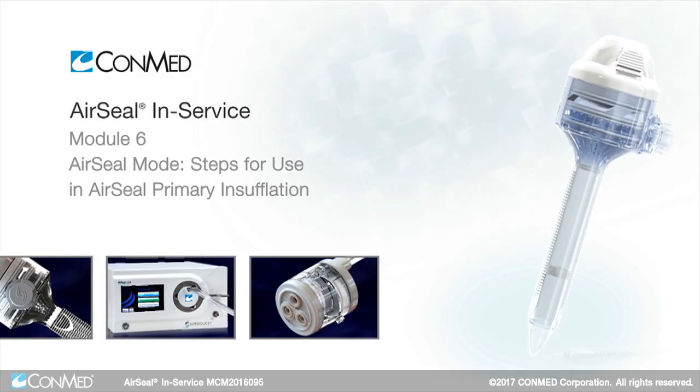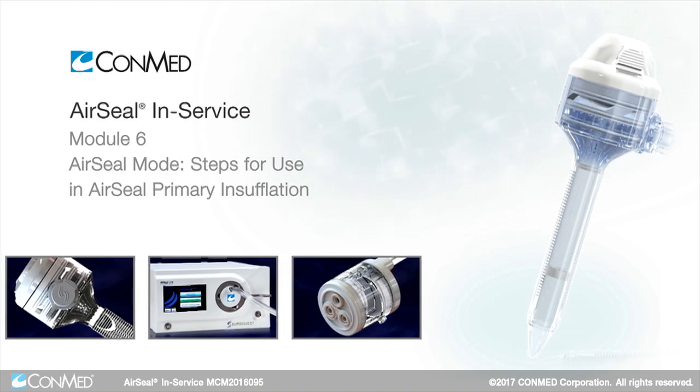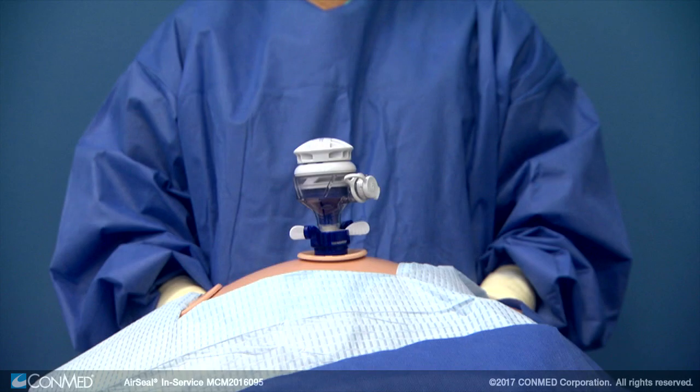Certain procedures will require the air seal access port to be placed first prior to insufflation. Either optically guided or using the Hassan open cut down technique, gain initial access to the abdominal cavity.